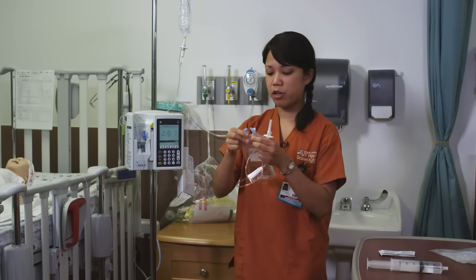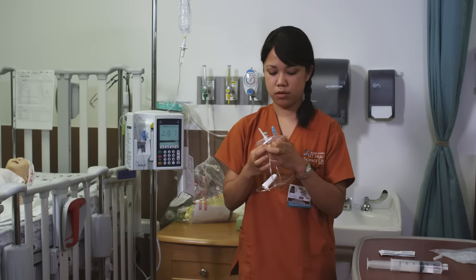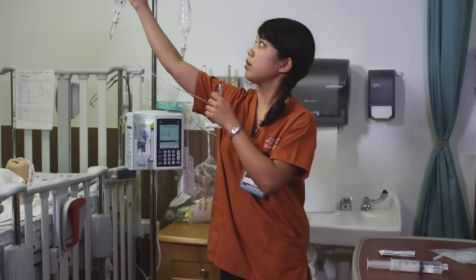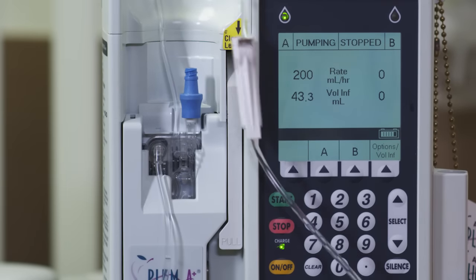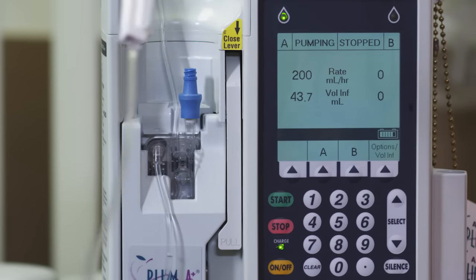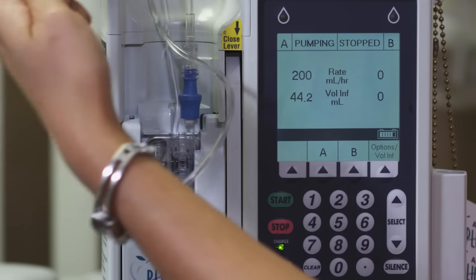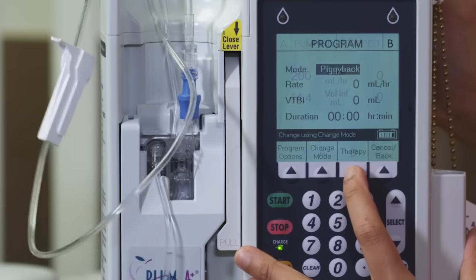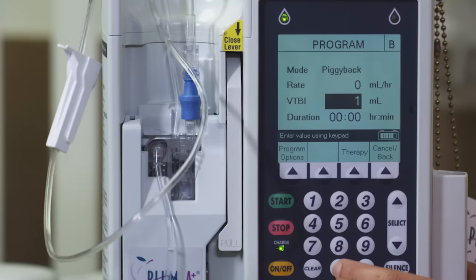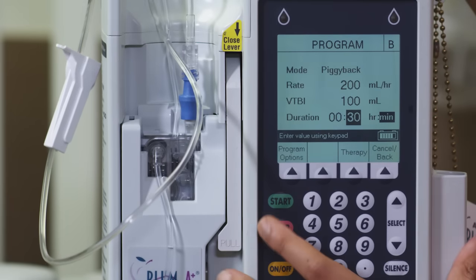Make sure your clamp is clamped all the way. Clean your hub — 15 seconds. Unclamp all the way. Select channel B, and again it says piggyback. Go down to volume; our bag is 100 mils, and we'll run that in 30 minutes. Go down to minutes, enter 30 minutes. That's going to run at 200 mils per hour. Start.